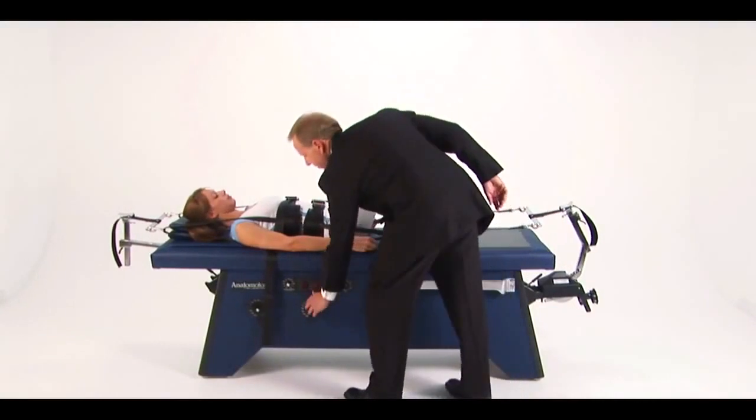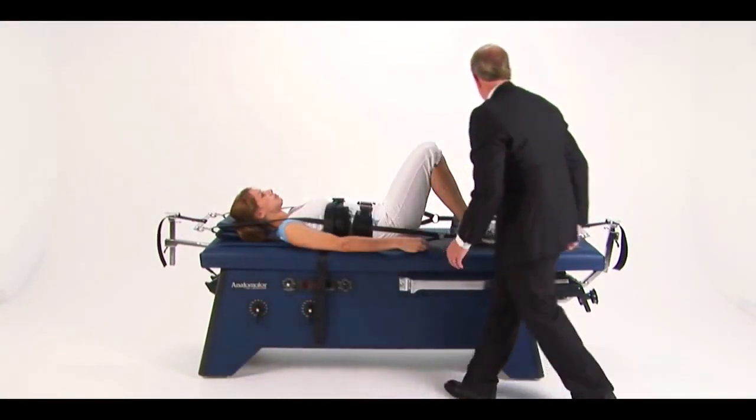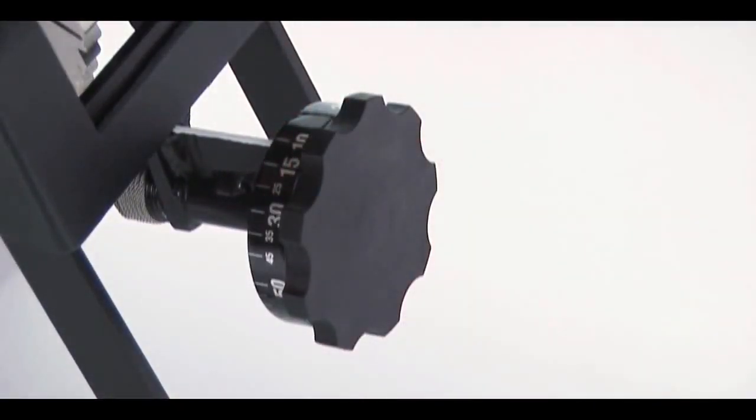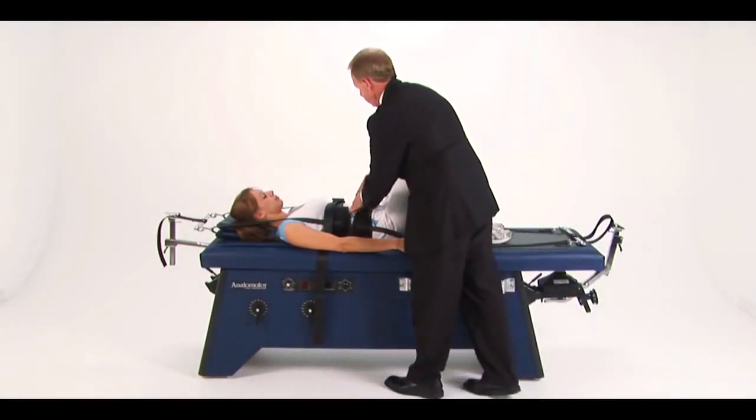At the end of the treatment, the timer will ring and the table will stop in the rest cycle of traction. Lower the rollers, turn down the poundage dial, and release the harnesses. Let the patient rest a few minutes before getting up.